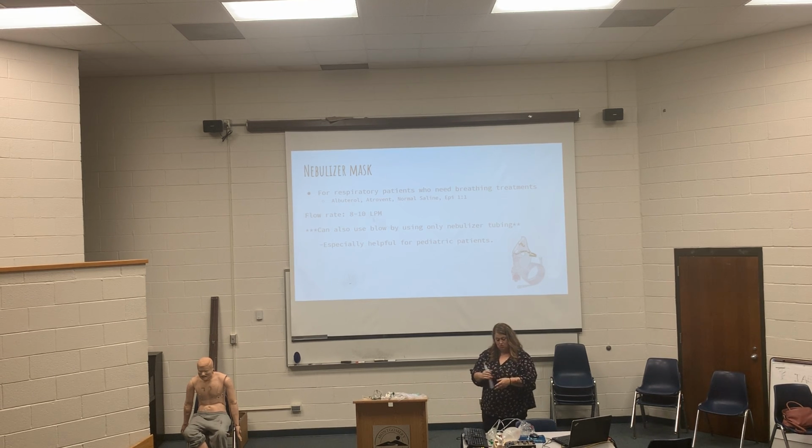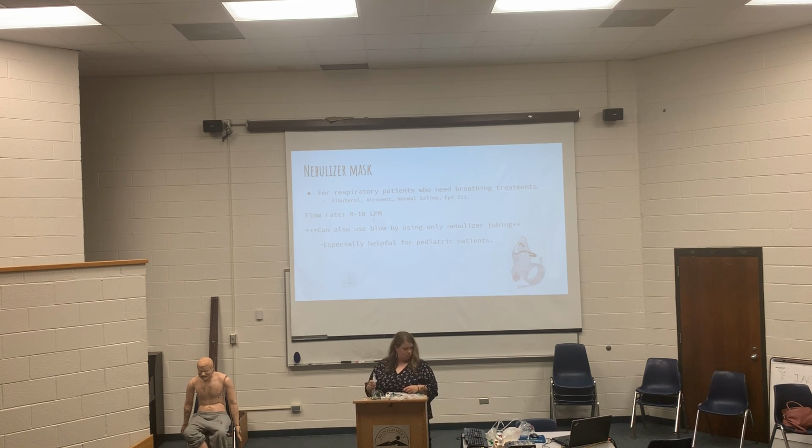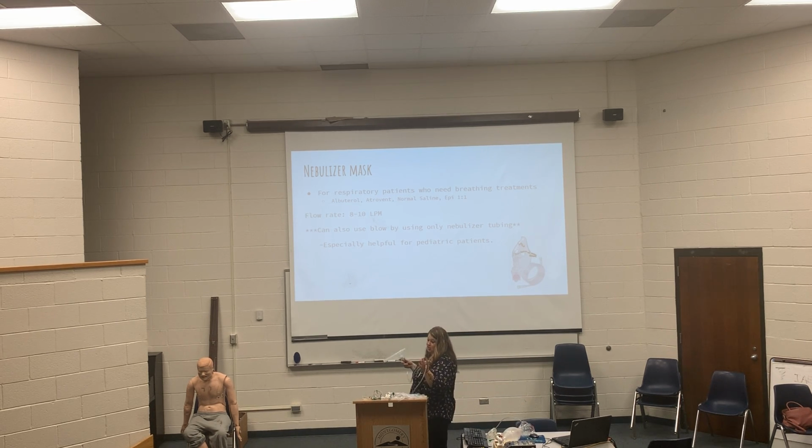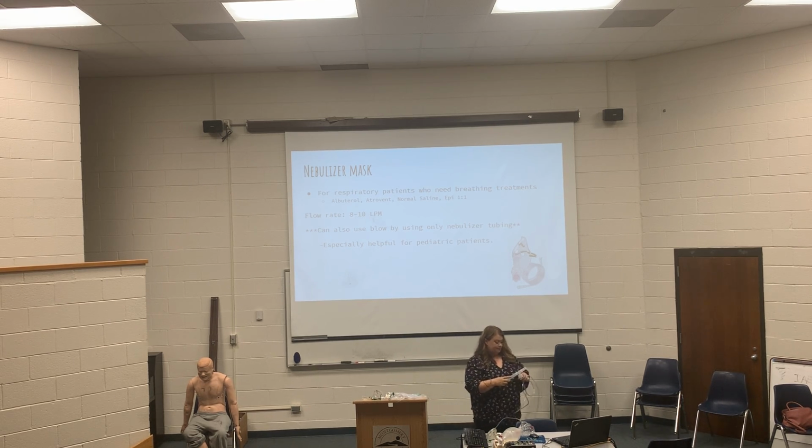And then you hook it to this, and then they're gonna smoke it. I was telling like a peace pipe or whatever. And then they can go at their own pace. It doesn't work as effectively as the mask, because with the mask, you're getting continuous airflow, but with this, they cough, they put it down, they start talking to you, they start waving it around, and if they start waving around a whole lot, this medicine will come out and it'll fling all over you and get in your eye.